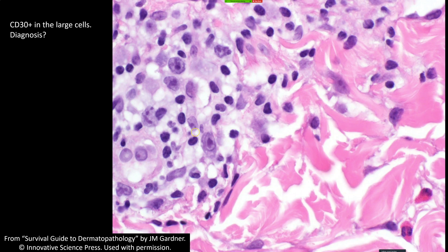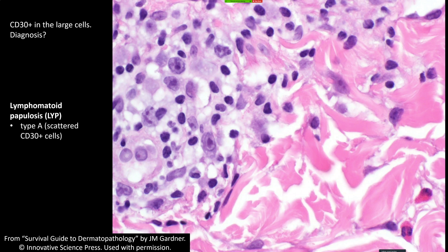What we're seeing is scattered large cells plus a mixed inflammatory background, often with eosinophils — that's classic. CD30 is going to be positive in these big cells. When you put all that together with the clinical history, this is lymphomatoid papulosis. Some people like to subtype it by letter, but it started with A, B, and C and now we're at D, E, F — we'll get to Z eventually and then start using Greek letters because there's so much alphabet soup.